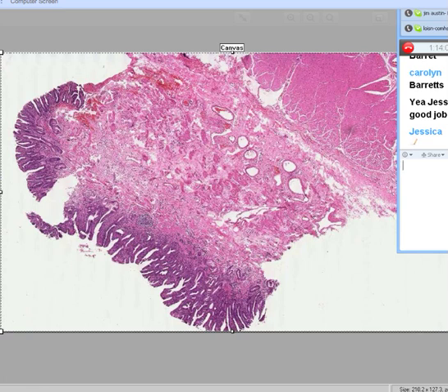That's the question, folks. And Jessica says, adeno. Of course it'll be adeno. Why? Because it's glandular epithelium.